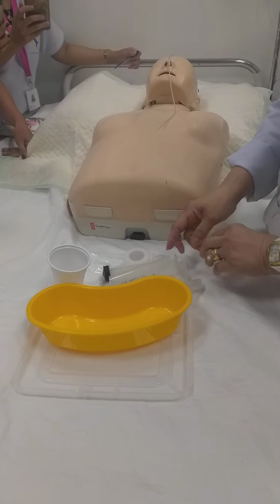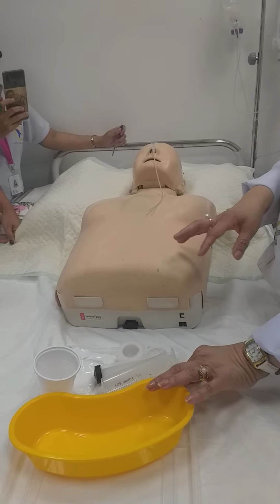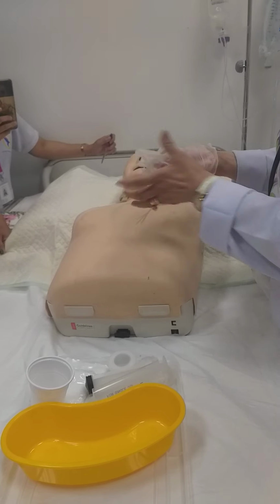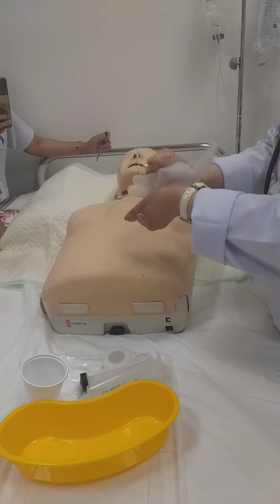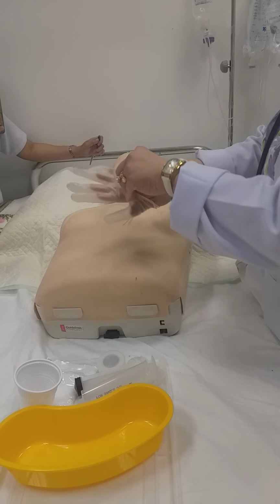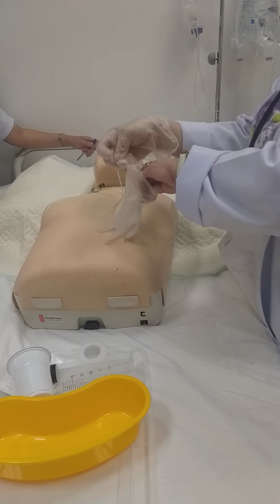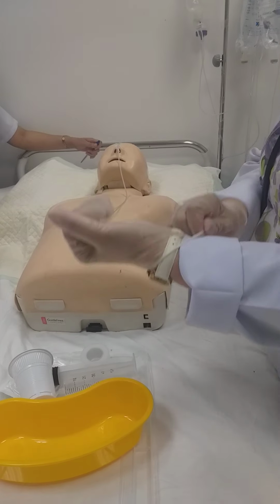Set aside. Now, because we finished putting the plaster, you can go on with the gloves. Okay? So, assuming we need a glove. You do not shake like this, huh? Just pop out. Okay? And put in your gloves. Take the other one. Okay, so we're now here.